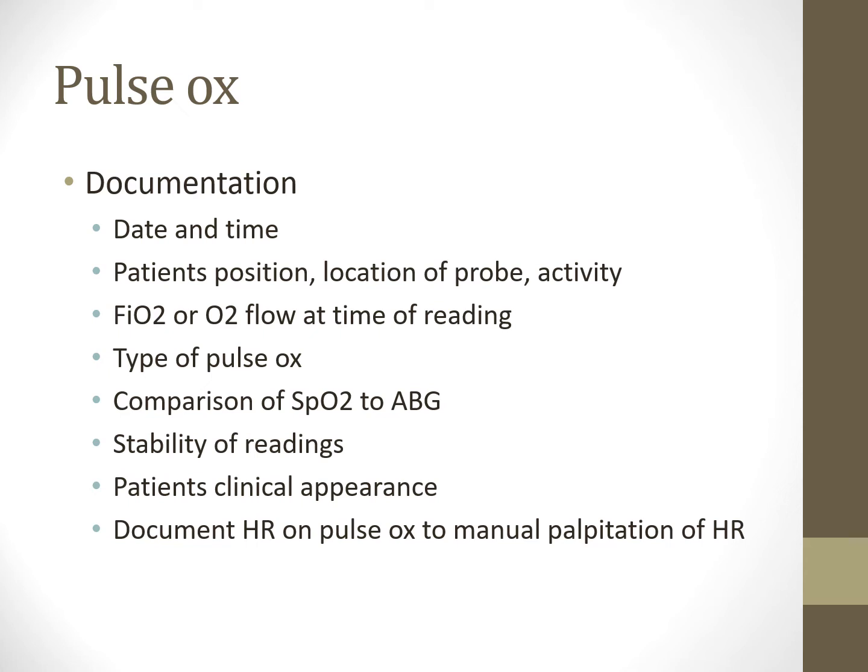So that's something you need to be aware of and ready for in critical care medicine, right? So I'm going to compare their EKG to the pulse ox heart rate. If the two heart rates aren't pretty in sync with each other, then I know there's probably an issue with the accuracy of my pulse ox. So that's how you check pulse ox accuracy at the bedside, you check the EKG heart rate against the pulse ox heart rate.